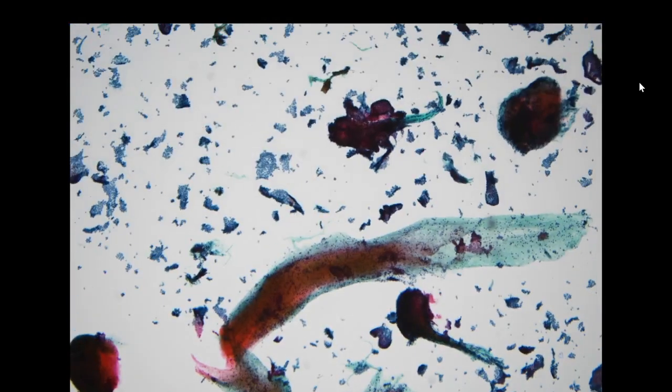So then we move to the fine needle aspiration. The first specimen is coming from a thyroid. So this is a classic example, right? This is hypercellular. In the background, we don't have a lot of colloid.